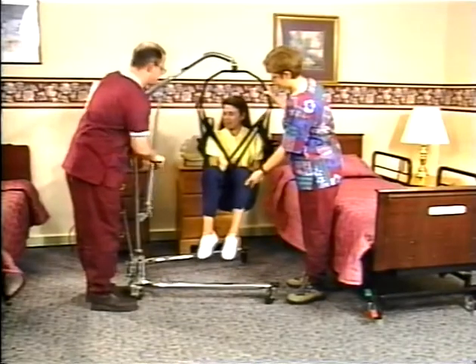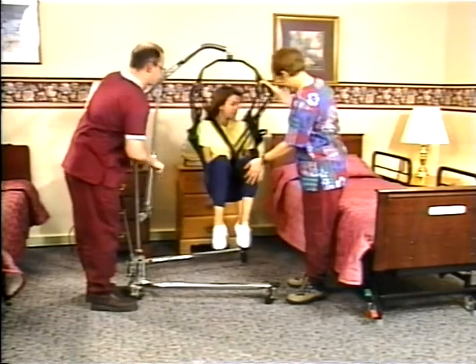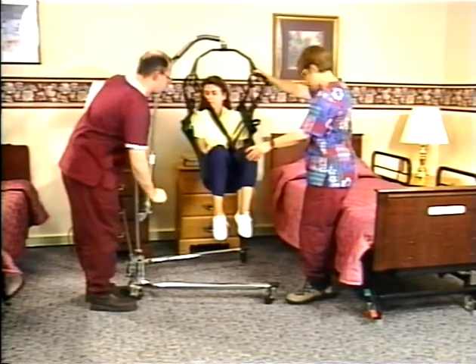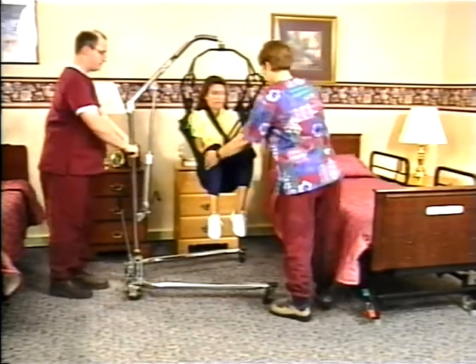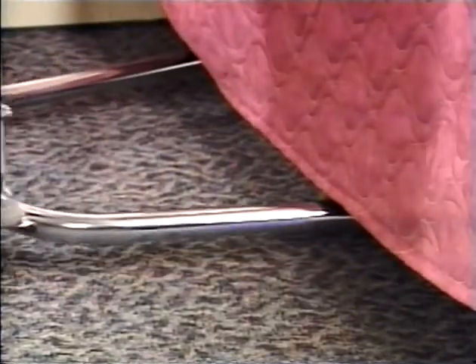Now let's transfer someone to the bed. First, lower the bed all the way. Raise your resident until her buttocks clear the top of the bed. Using the steering handles, move the base of the lifter all the way under the bed. Get her centered over the bed.